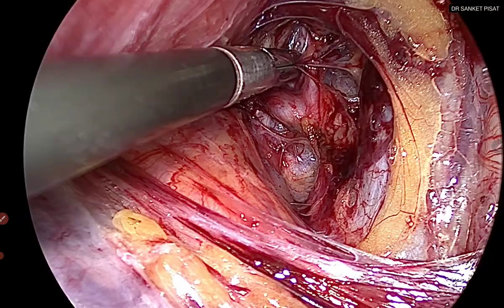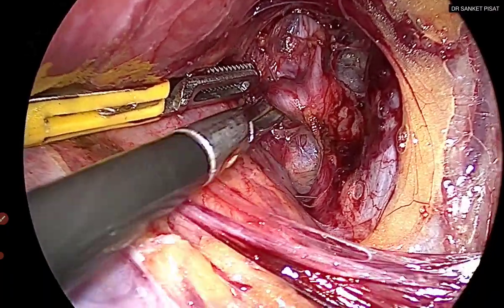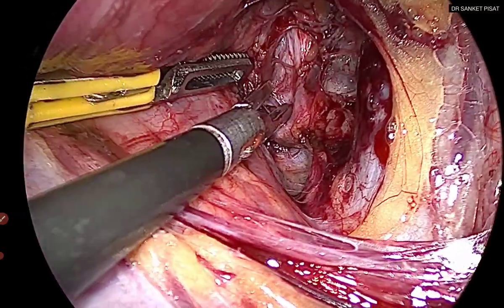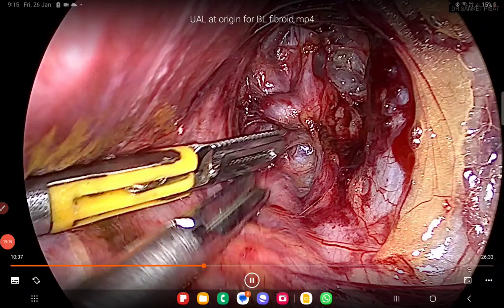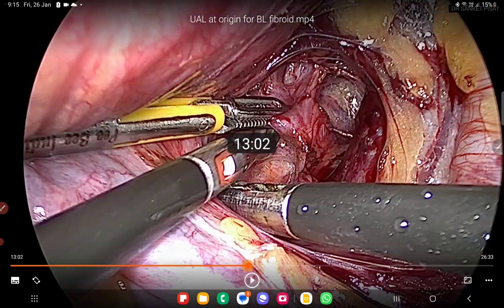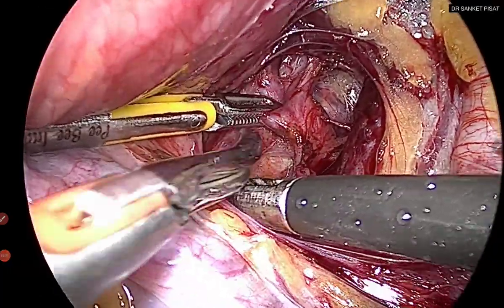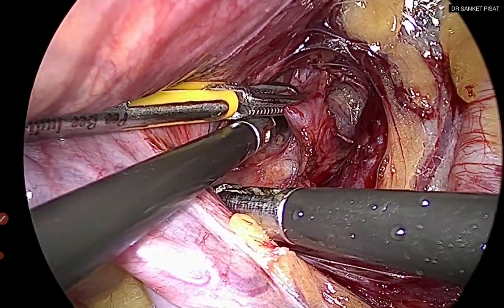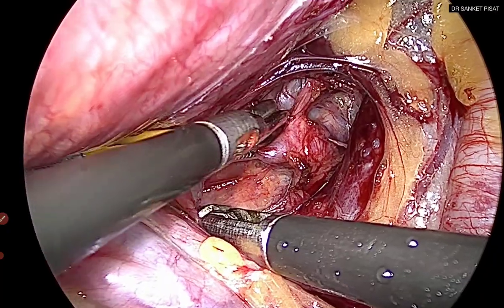The anatomy is now reasonably clearly defined. The uterine artery is seen coursing medially, and the pulsating uterine artery as well as the obliterated hypogastric artery and the internal iliac anterior division from where it is originating are clearly seen. I am now planning to choose between coagulating the vessel or ligating it. I am gently going underneath the uterine artery, holding it with my bipolar grasper, giving a slight pull, and using the bipolar vessel sealer to tunnel under the vessel.